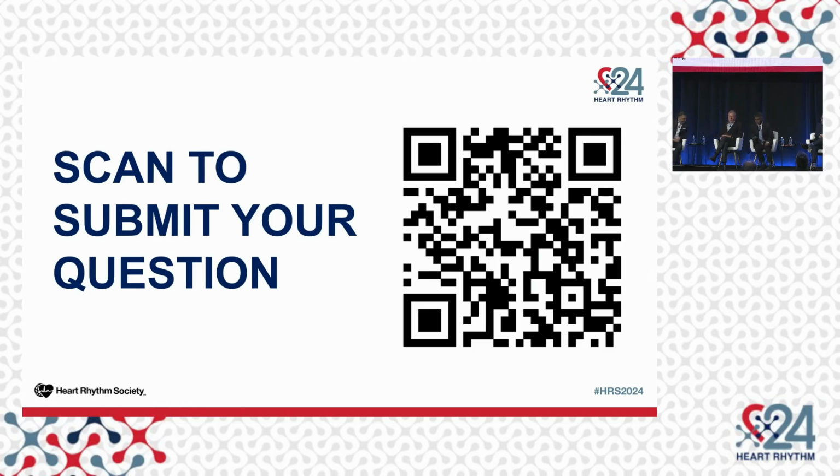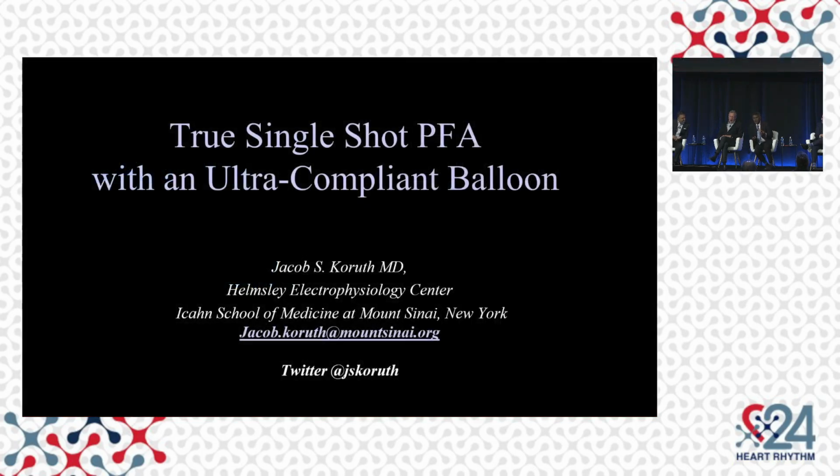Thank you, and thank you for the opportunity to be here. Before I move through the slides, I'd like to make one point. We have an opportunity of using a tool that we developed in the world of thermal ablation over many years and perfected the structure of the tool to fit different PVs, to make a lesion set that has worked for us in our patients, as you just heard. It's truly nice to be able to take the same tool and apply a new energy source so that you get the best of both worlds. And I think that's where this change from the laser balloon to the PFA balloon, retaining all the features of the laser balloon, is why I think this particular approach is special.